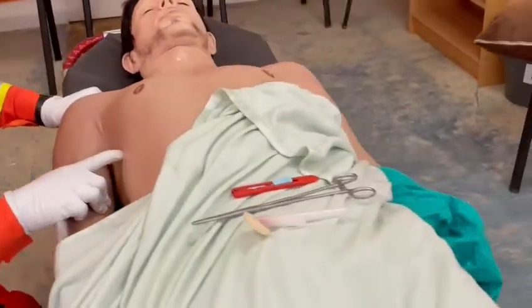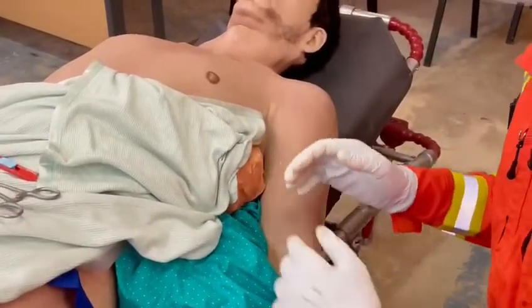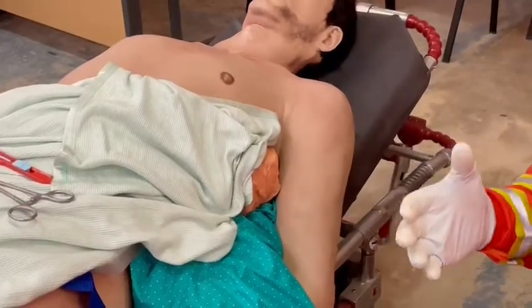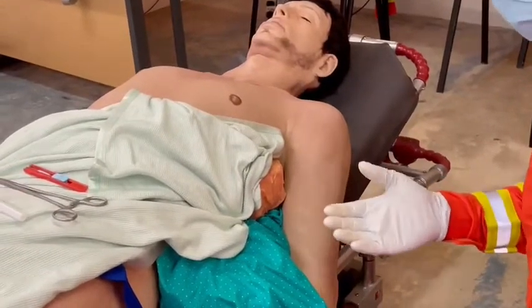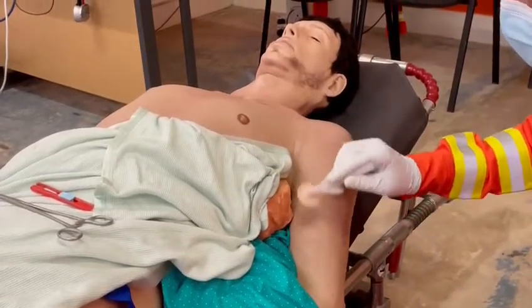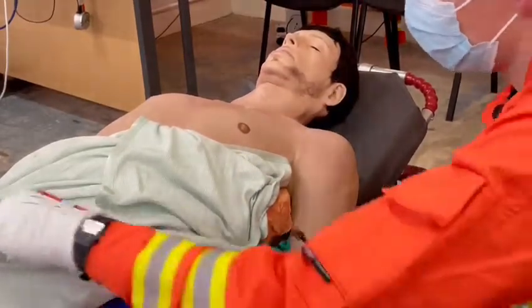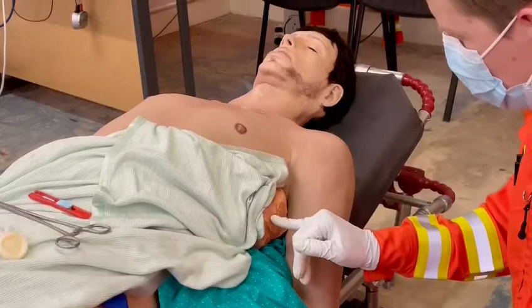We're going to move to the other side of the patient's chest to demonstrate how the incision is made. Ideally I'd have sterile gloves on, expose the chest, and move the patient's arm out of the way. If available, I'd use local anaesthetic or sedation for the patient, because the procedure involves an incision and is likely to be painful. I'll use something to clean the area thoroughly, then sense check and confirm my landmarks are correct.